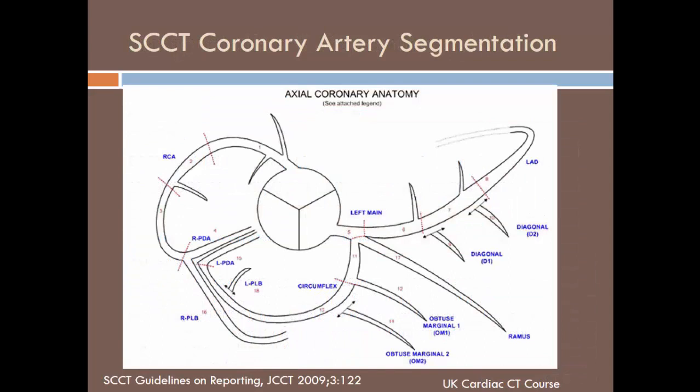The way the coronary arteries are divided into different segments is similar to the AHA way of dividing coronary arteries into segments on invasive angiography, with some very minor differences. So this document actually gives those differences in detail, but I went through them with you in the anatomy talk yesterday.